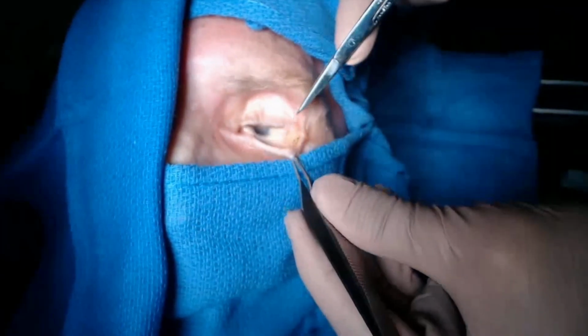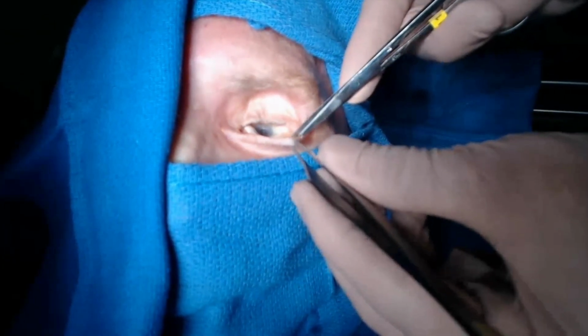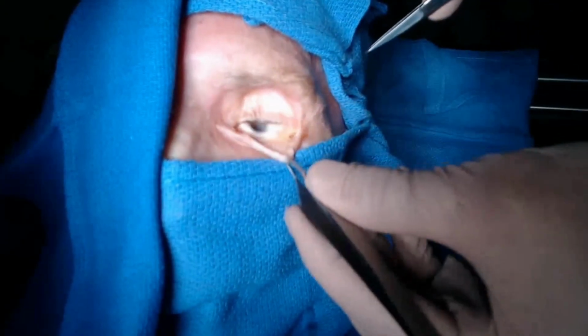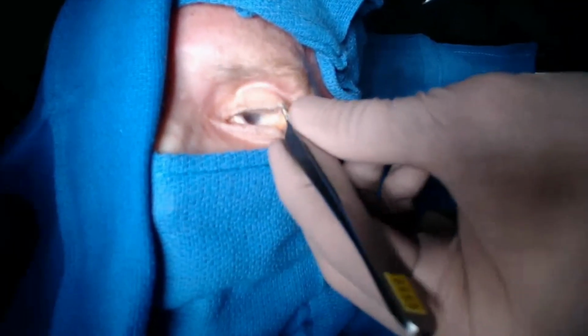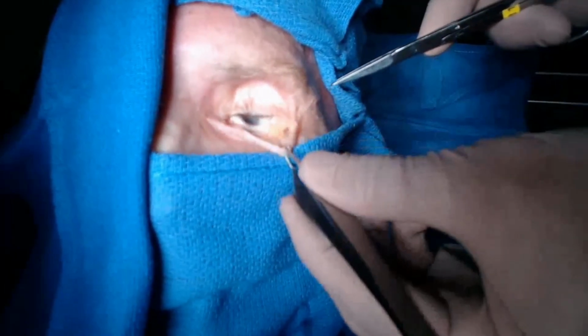not required. Next, the inferior cantholysis is carried out with one hand gripping the inferior lid margin and the other using straight scissors pointed toward the patient's opposite shoulder. The inferior canthal tendon should feel more taut than the normal surrounding soft tissue, and you will know it is released when the eyelid gives way and you can no longer strum across more firm tissue.